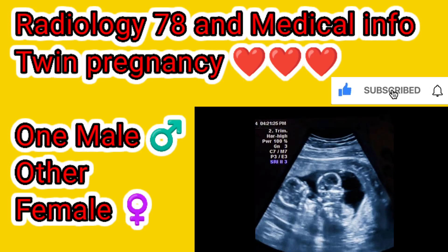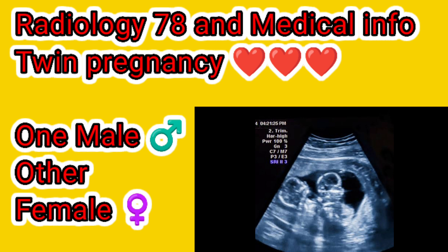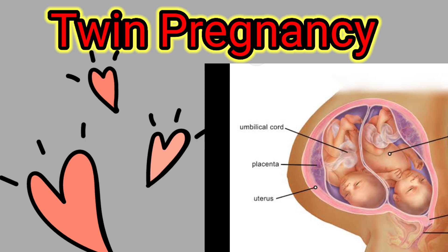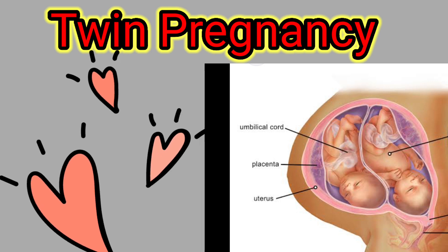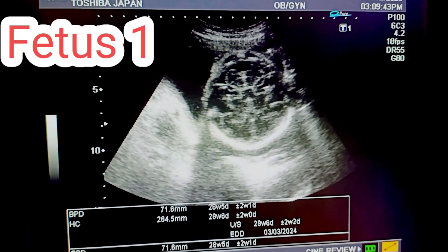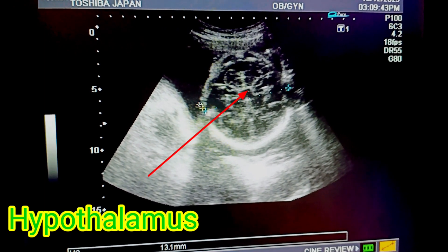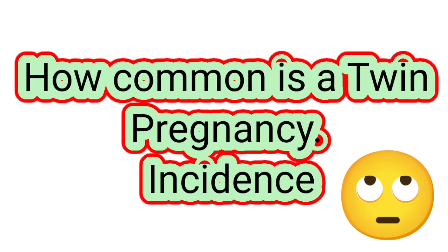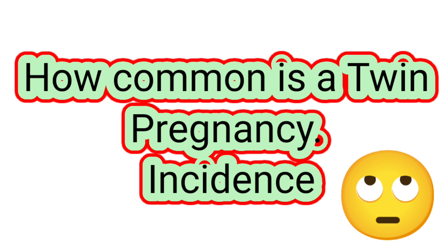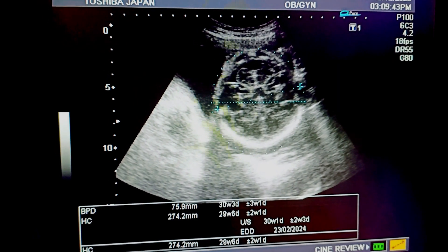Assalamu alaykum viewers. This is an interesting video regarding twin pregnancy — one fetus is male while the other is female. Please watch the video till the end as you will find a lot of information regarding twin pregnancies and different syndromes associated with it. This is the pelvic scan of a 25-year-old female who has twin babies. The first fetus is in the cephalic position and we would like to find the BPD. Do you know how common twin pregnancy is and what the incidence is? You will find the answer in the coming frames.